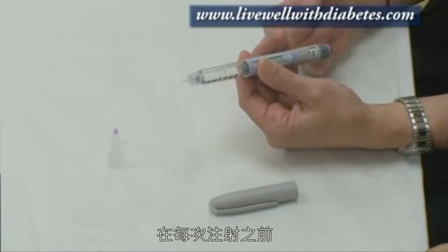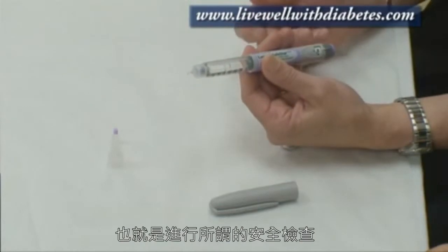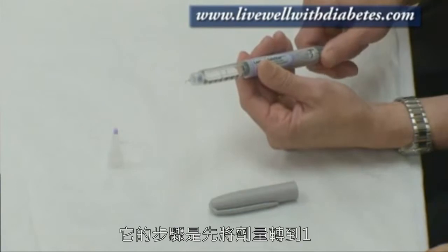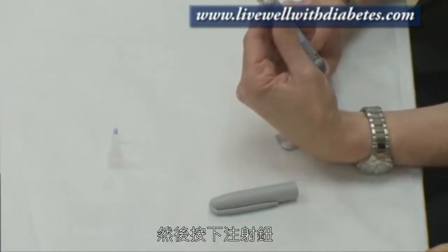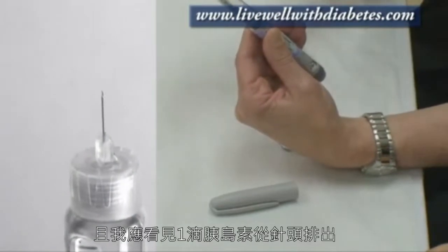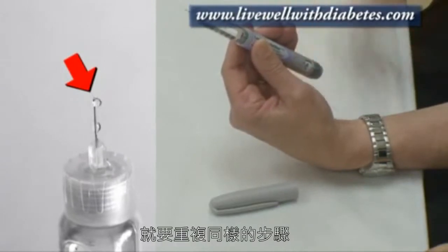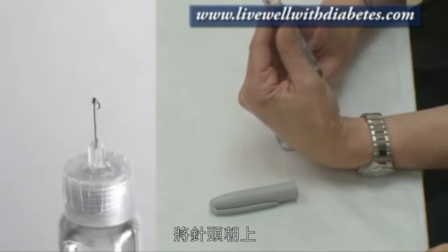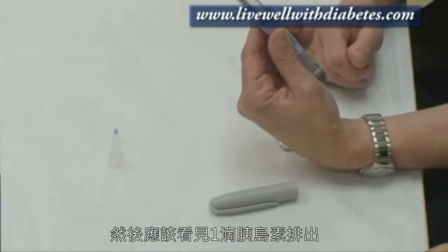Before each injection I'm going to prime the pen, or do what's called a safety check. To do the safety check, I would turn it to number one, point the needle up, and push the button. When I push the button it will turn to zero and I should see a drop of insulin come out. If I don't see a drop, I repeat this step — turn it to number one again, point the needle up, push the button on the end, and I'll see a drop of insulin come out.